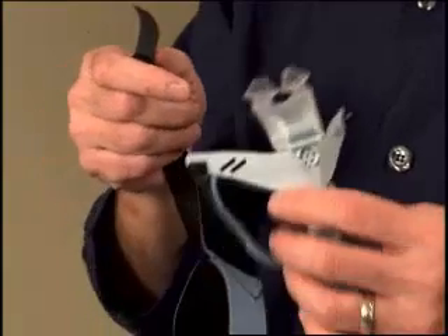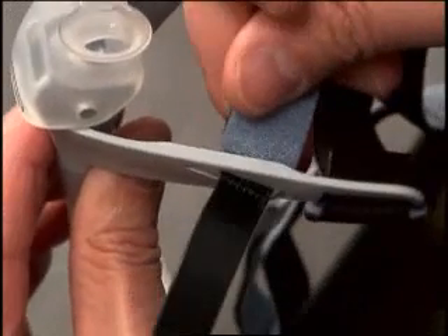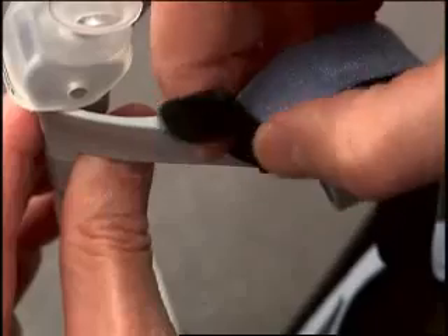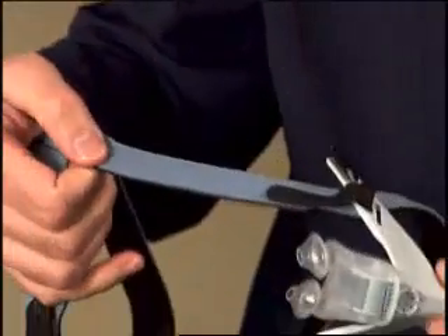To attach the headgear straps, hold the interface as you would place it on your face. Insert the ends of the thin black headgear tabs through one of the two remaining slots on each side of the interface, from the inside of the interface to the outside. To hold it in place, attach the black tab to the headgear. Before attaching the other side, make sure that the side straps are not twisted.